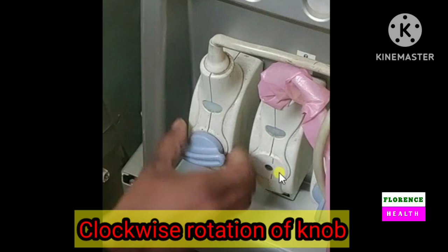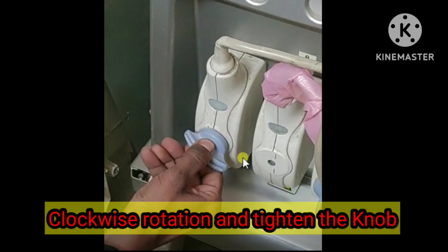Now you should give clockwise rotation of the knob and tighten the knob. The entire process should be slow, gentle and steady. Again give clockwise rotation of the knob and tighten the knob.